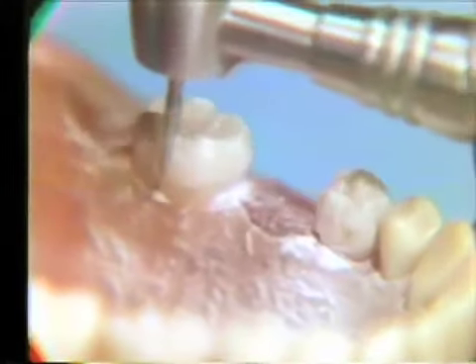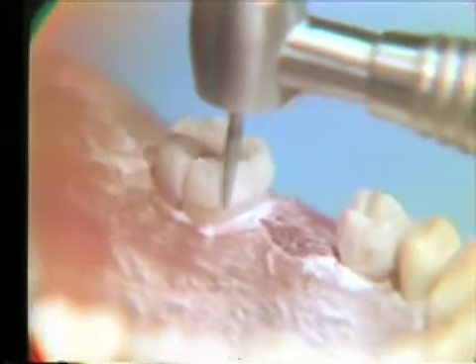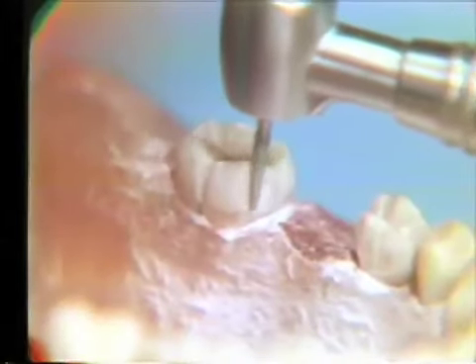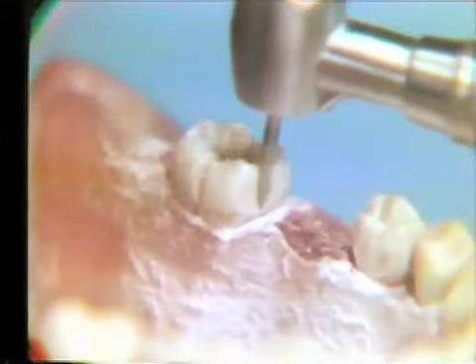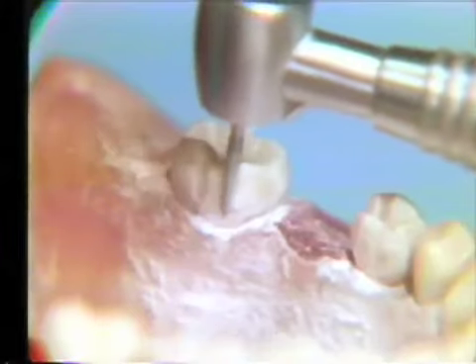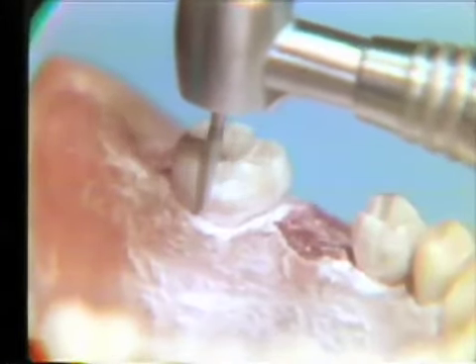Here again, it is important that the handpiece is held in the long axis of the draw of these abutment teeth. The taper of the diamond instrument will establish the taper in the preparation. The tip of the diamond is carried to the extent of the finishing line, the cervical finishing line of this preparation. The mesial buccal portion, or reduction, is carried out and blended into the original mesial lingual reduction. And the distal slice of the bicuspid completes this peripheral reduction in the bicuspid tooth.